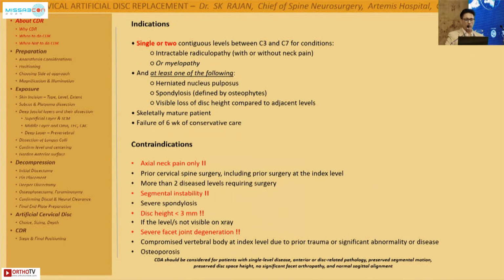In terms of contraindications, this is extremely important because we do tend to be enthusiastic about placing cervical discs by CDR, especially if you've done a few cases of normal ACDF and anterior cervical plating. So it's extremely important not to do this surgery for patients who only have neck pain. There are other contraindications as well, but segmental instability is also one of the major contraindications.